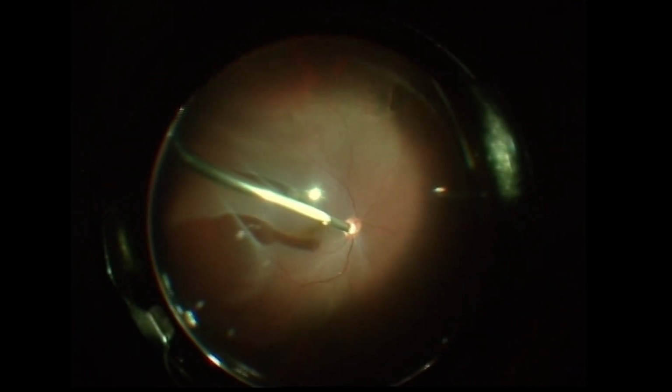Suddenly, we noticed a donut-shaped air entrapment behind the lens. After confirming that the infusion was still intravitreal in position and confirming that there is no subretinal slippage of infusion cannula, the procedure was continued. Continuation of fluid air exchange resulted in subretinal air migration.